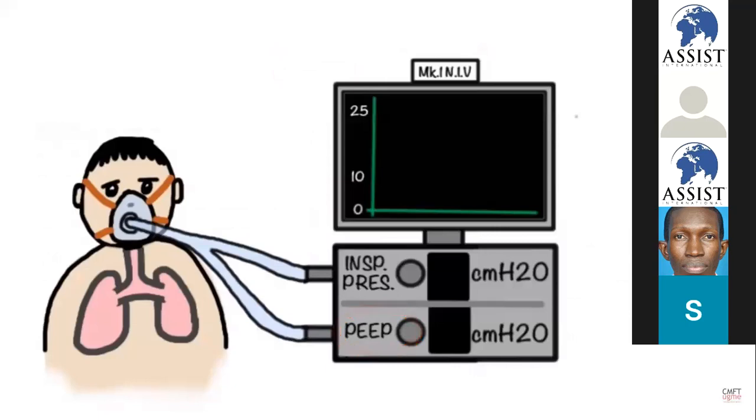As before, this pressure helps prevent the alveoli from collapsing. Secondly, the pressure that creates the push. This is the inspiratory pressure, which increases the size of each breath or tidal volume. The bigger the pressure, the bigger the push, the bigger the tidal volume.